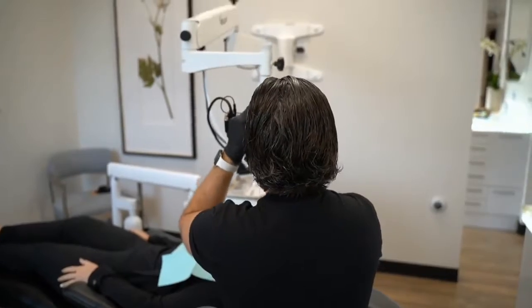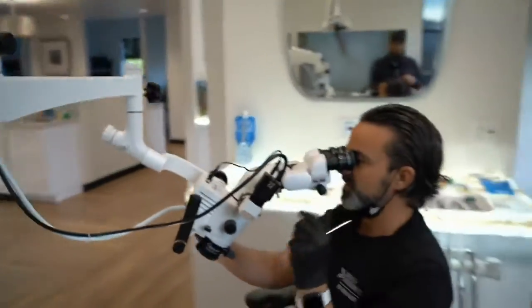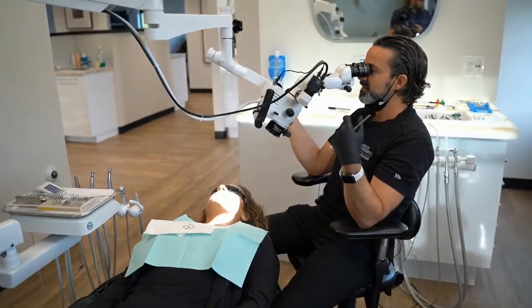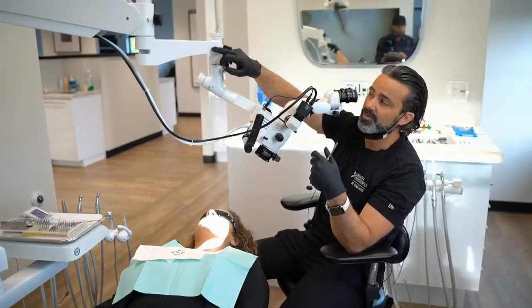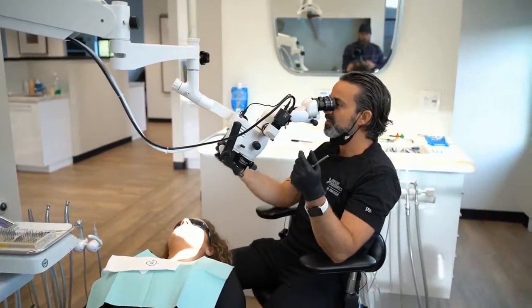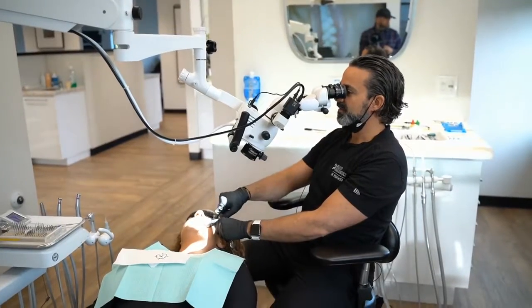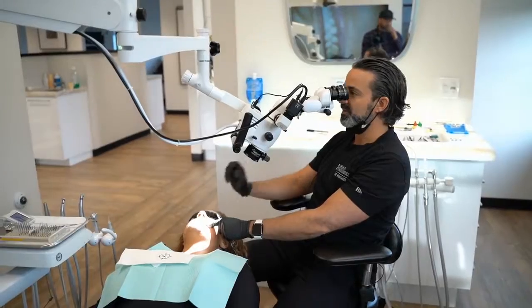The other thing is, sometimes you will do this lean-back approach, like if you're doing a class 5, you'd be reclining a bit like this. And I find that this top extending arm is really good for reclining if you want to ease in, especially on the lower class 5, like so, if she were to open up, bite down. So if I'm wanting to look like this and work like that, that's where we go, like so.